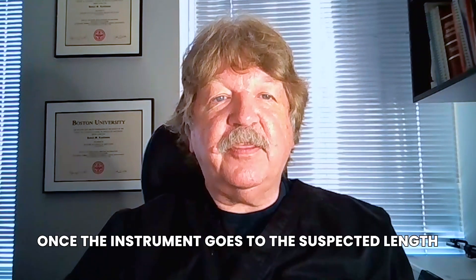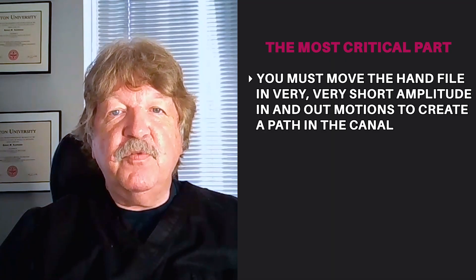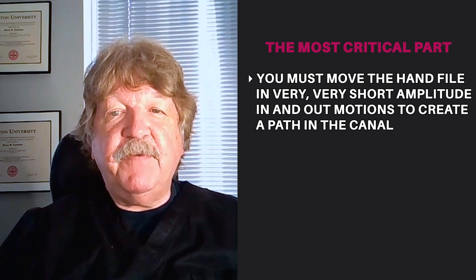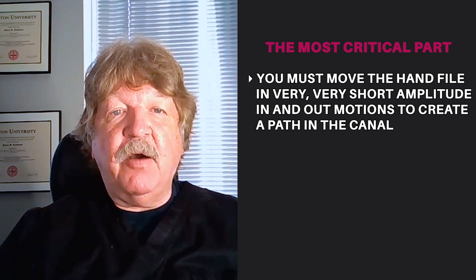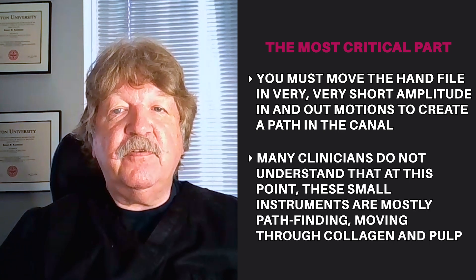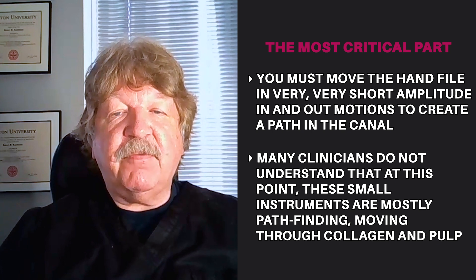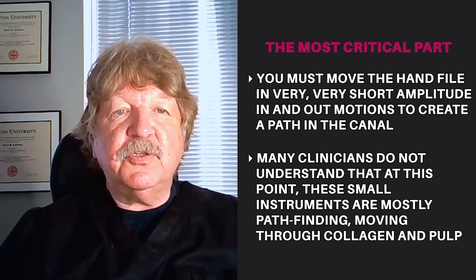Once the instrument goes to the suspected length, check the length with an apex locator. The most critical part now occurs. You must move the hand file in very, very short amplitude in and out motions in order to create a path in the canal. Many clinicians do not understand that at this point, these small instruments are mostly pathfinding, moving through collagen and pulp. Invariably, you will remove the instrument too far and then be unable to reinsert it again because it hangs up on a ledge or some sort of obstruction.